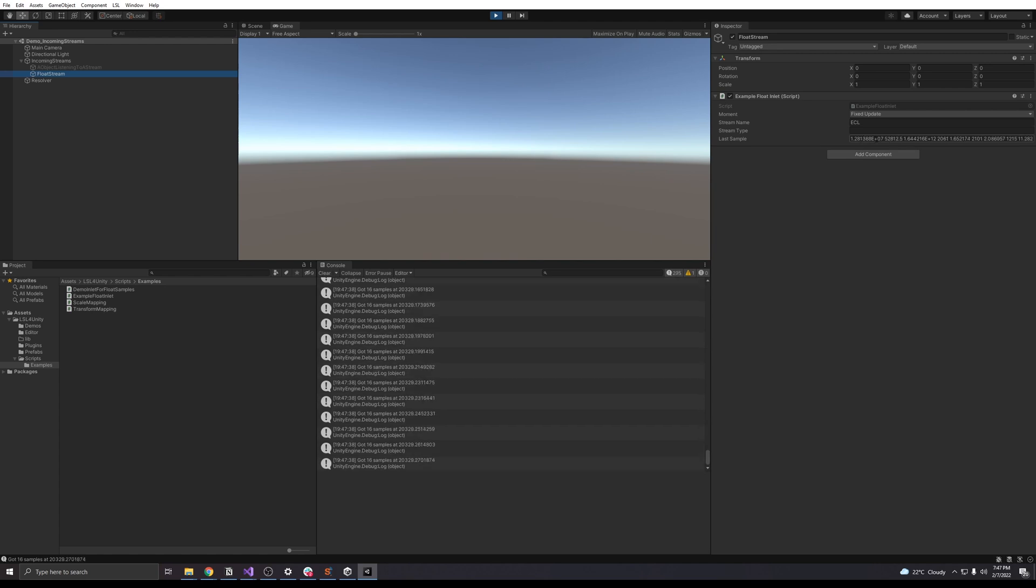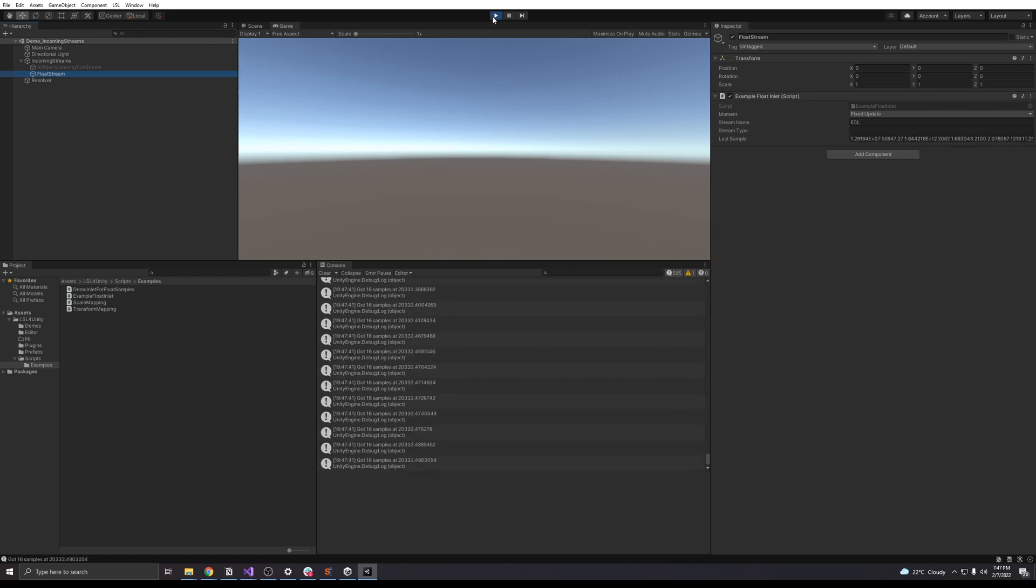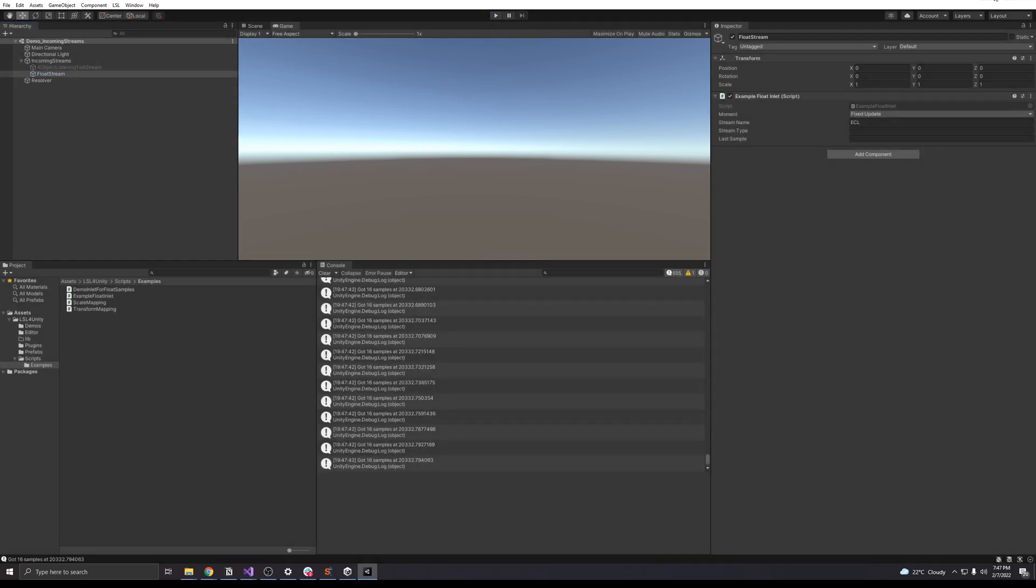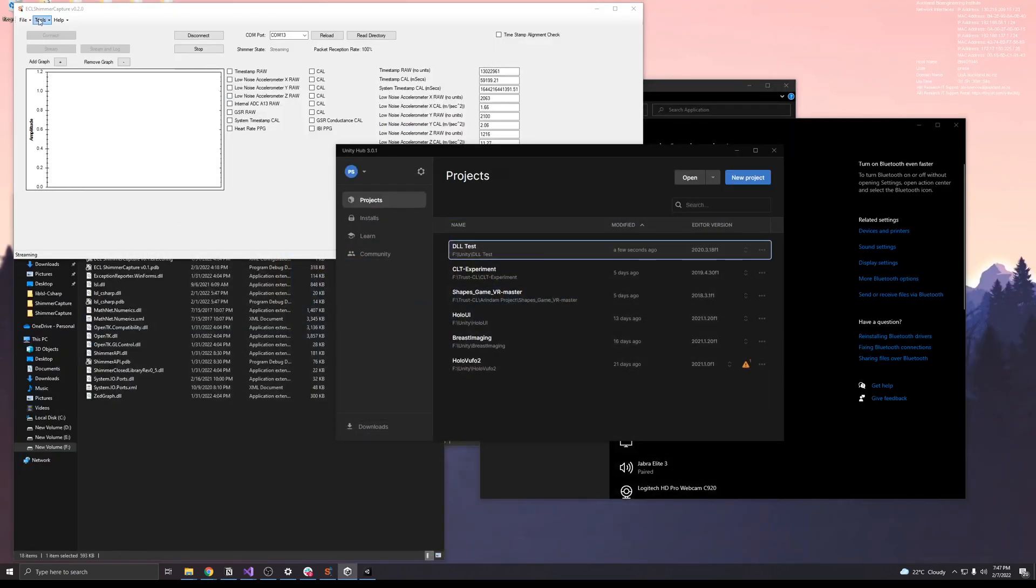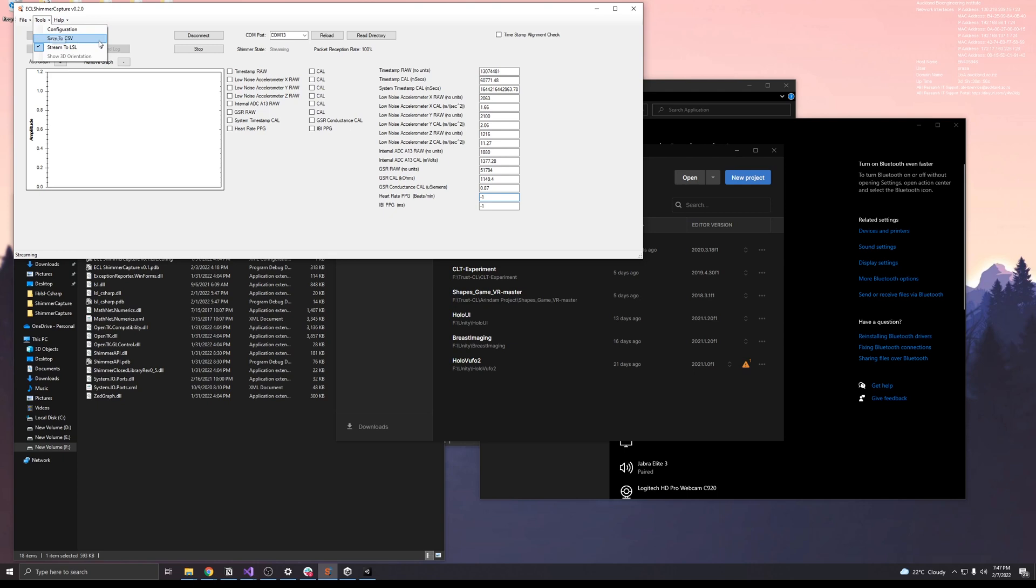You can see that the physiological data is being streamed. You can edit the parameters to the stream as needed.